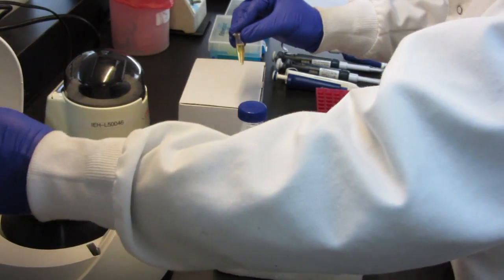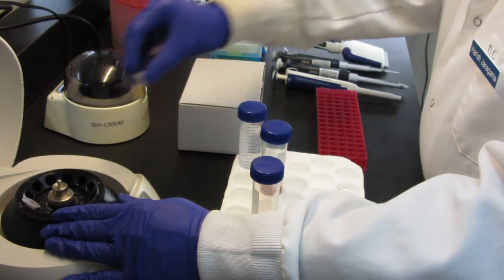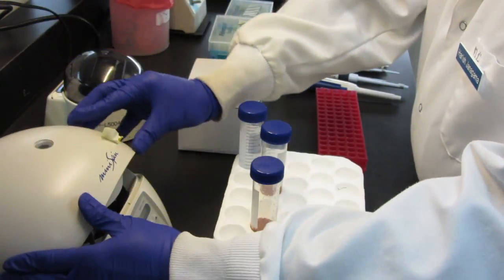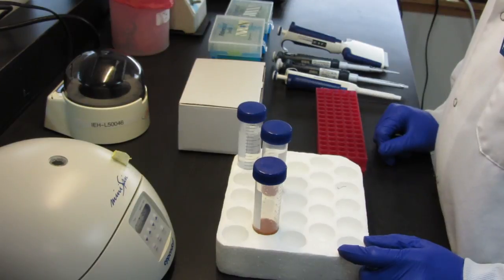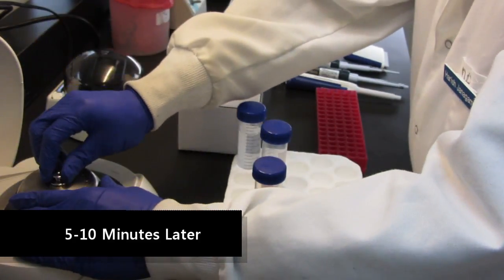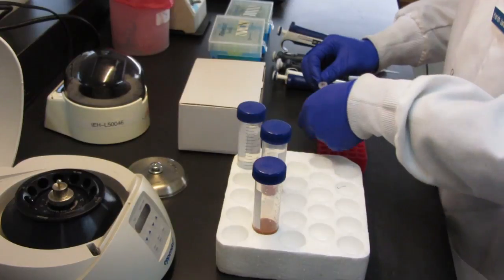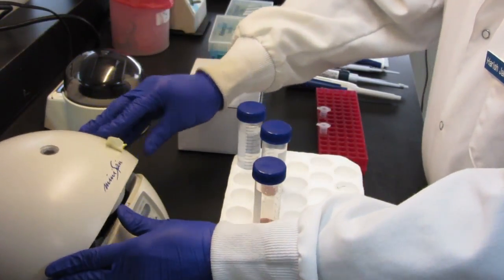Centrifuge the samples at 10,000 times G for about 5 to 10 minutes. Take the tube out and carefully pipette out the contents. Make sure at this step you do not disturb the pellet.